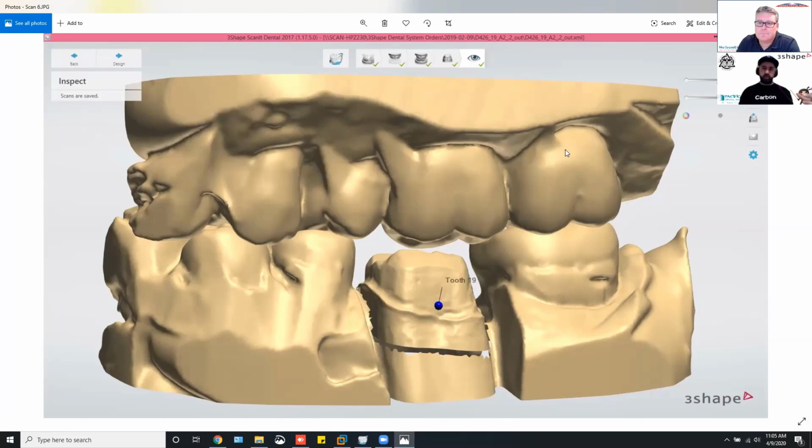As soon as one comes off, I actually hear the scanner. I listen to how it runs. I hear when the wind down time is. On the E3s, as soon as it's done, there's another little quick adjustment, and then the light comes on, so you have time for post-processing. While you pull that off, you click on the opposing icon and drop your opposing plate in there. It starts doing the pre-scan while you get your die off onto the third plate, and then trim your bites, your prep scan, and go back to the opposing.